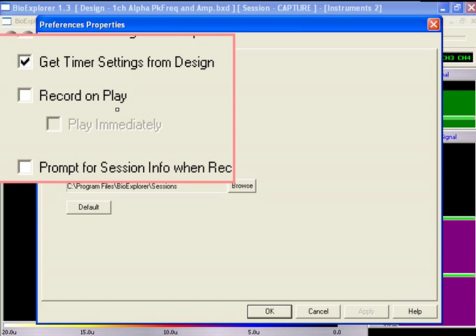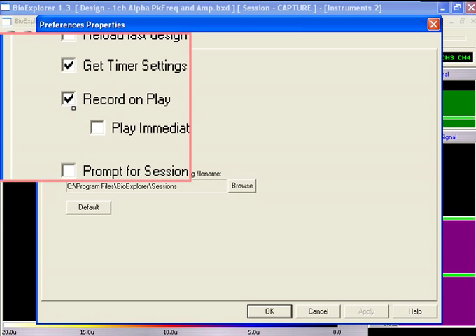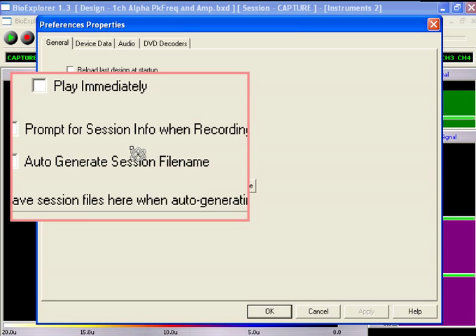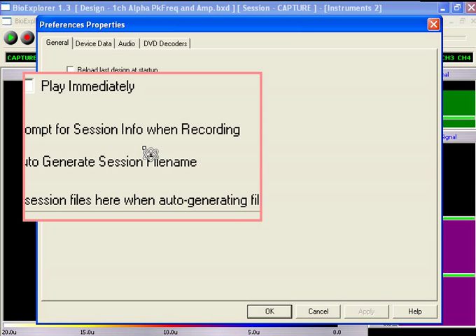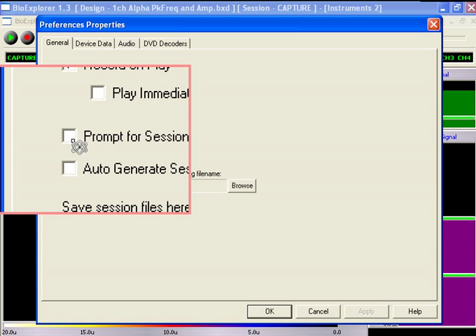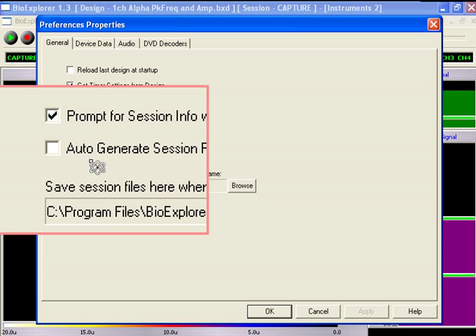To generate data, we have to record the session, so check it. Prompt for session info when recording opens a box where we'll enter identifying information every time we record a session.